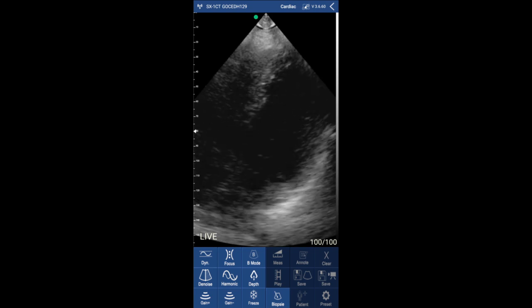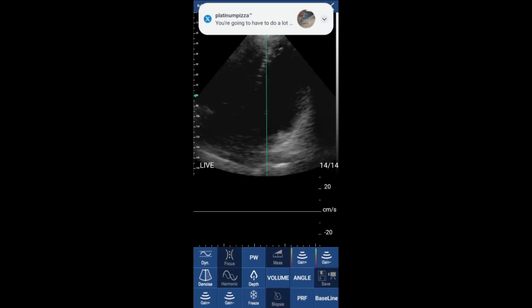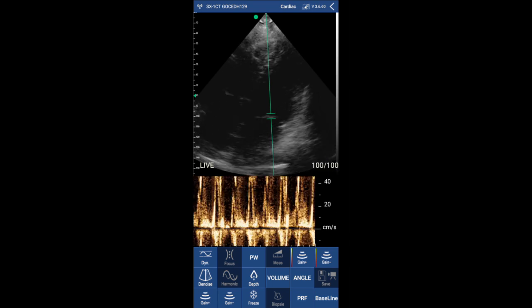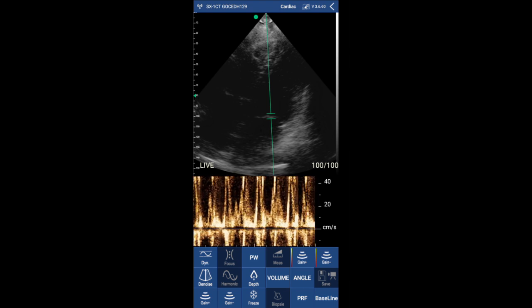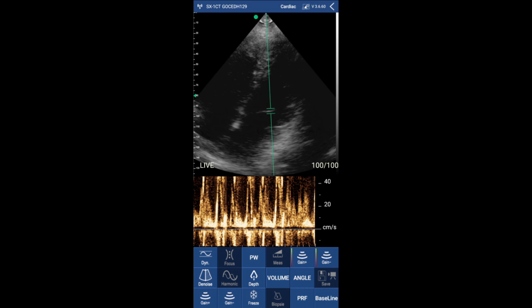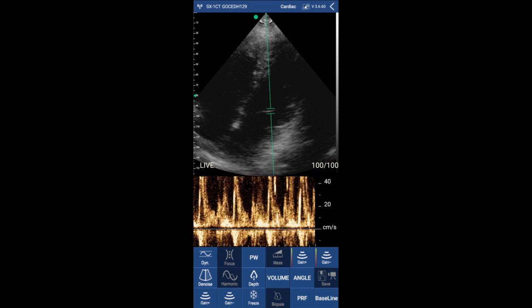Now I'm changing to the pulse wave Doppler to try the mitral valve inflow. You can move the cursor around and adjust the baseline to obtain a better pulse wave Doppler. You can clearly see here the E wave and the A wave. The more you use it, the more you'll get used to it. I'm very pleased with the image quality and all the tools and things you can do on the app.